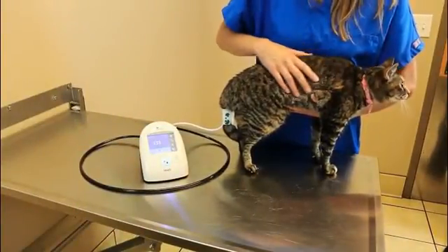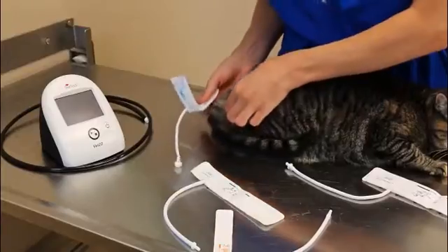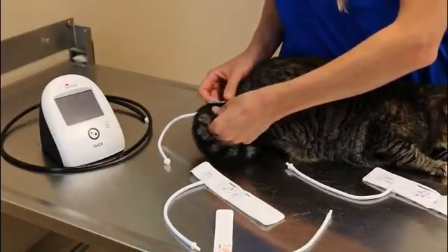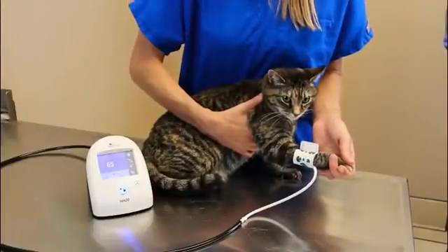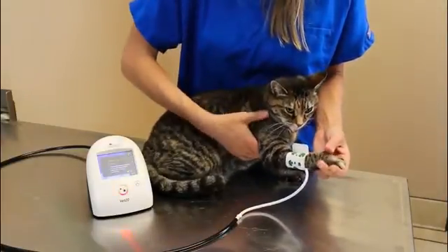If the patient is standing or not cooperative, the cuff can be placed on the tail. The tail is typically close to heart level and should not be moving. Be sure to wrap the cuff tightly around the patient's limb or tail to press down the animal's fur. The cuff is the sensor, so a snug fit is needed. A loose cuff may produce bad results or failed measurements, as the signal from the artery is not adequately captured.